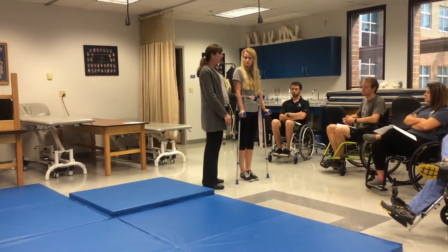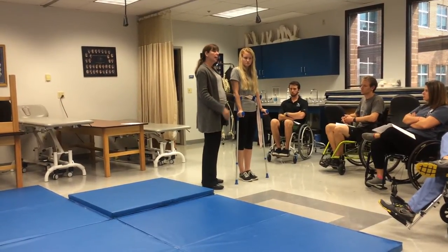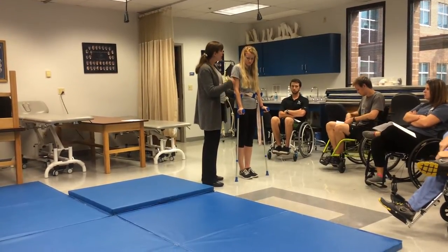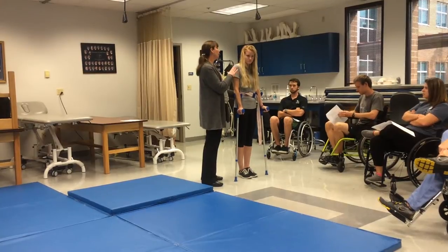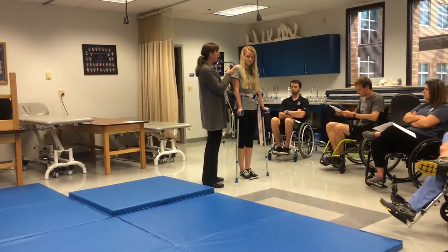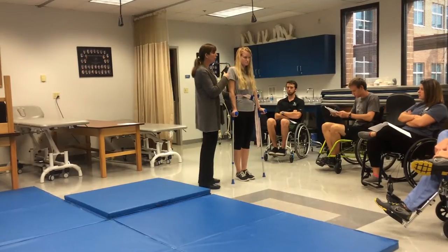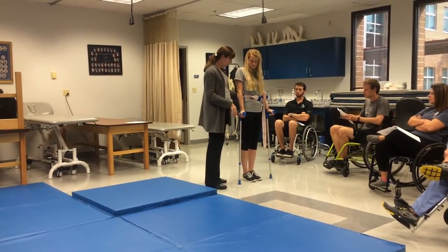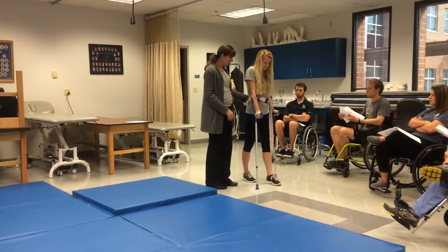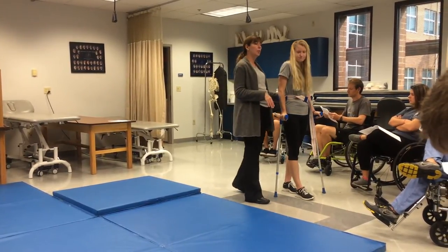If your patient had quadratus lumborum or hip flexors, what kind of gait pattern can they walk with? A reciprocal gait pattern. Now you're at level L2. You still have knee-ankle-foot orthoses because you do not have quads. You still don't have hip extensors, so you still rely on that Y-ligament mechanism during stance phase. You're going to bring the right crutch, the left leg, the left crutch, the right leg — four-point gait.